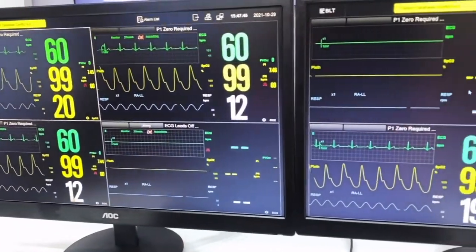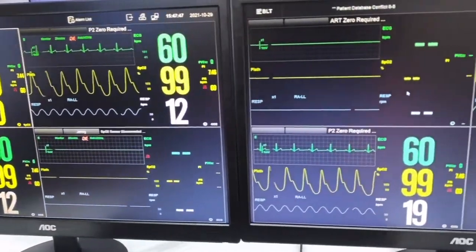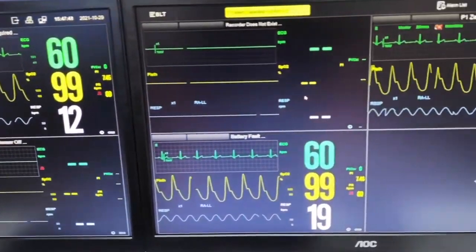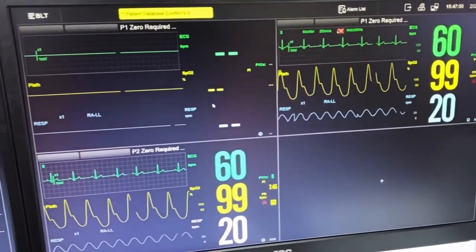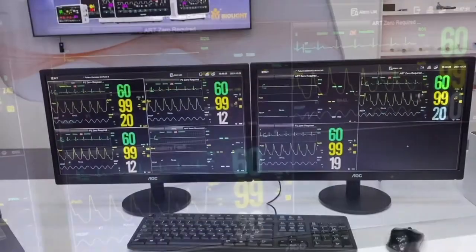Hi everyone, this is Jimmy from BioLite. Today we will be introducing our brand new CMS BioVision.